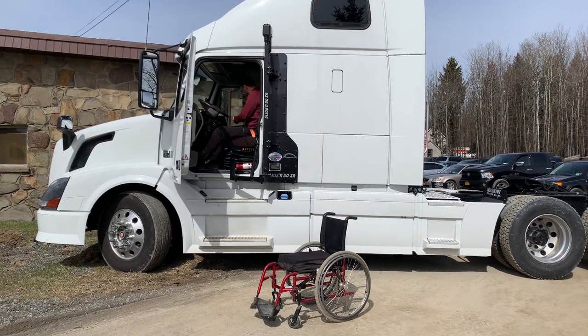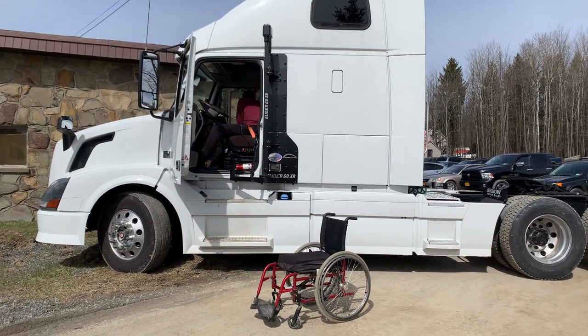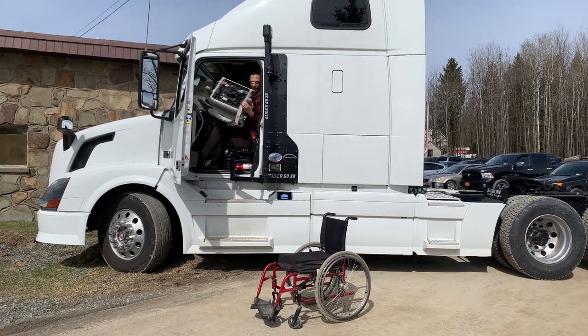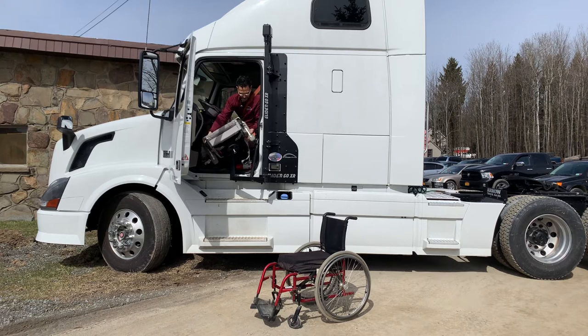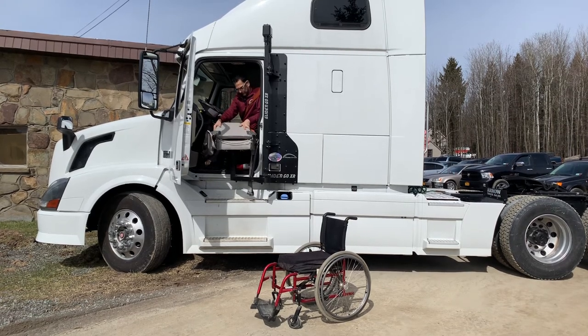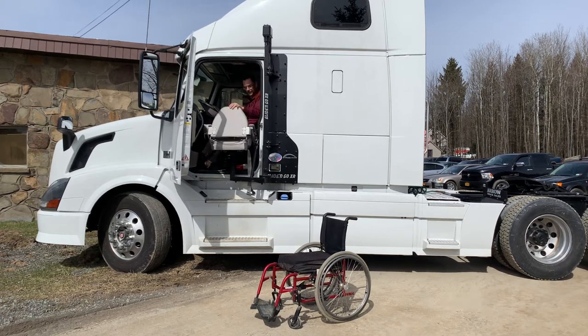And I'm going to put our seat right on it here. You've got your seat belt right there, and you're going to lift that right off.